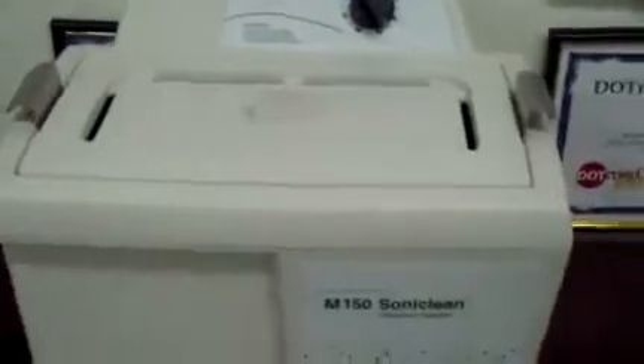Hey, it's DCSP Medical. Today we're looking at a Midmark M150 Soniclean. It's an ultrasonic cleaner.